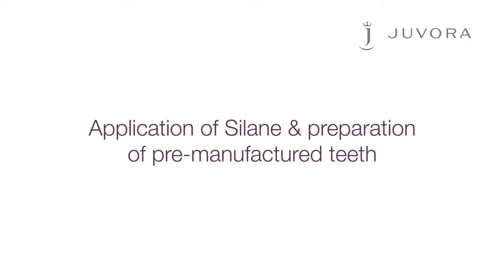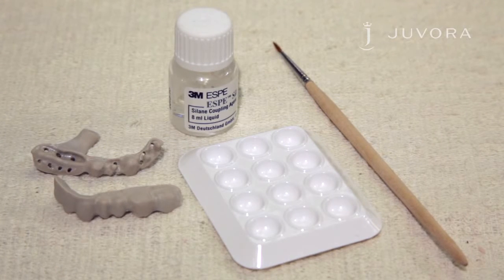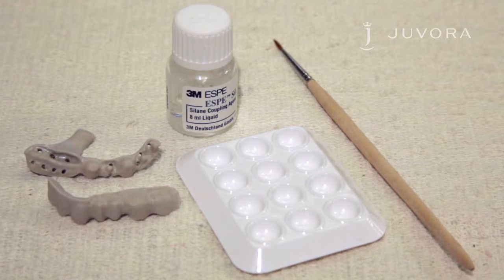With the framework and teeth prepared, you need to apply silane to the framework. The silane used in this case is 3M ESPE Sil. The full recommended list of systems is displayed at the end of this video.